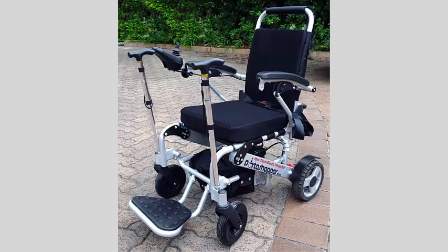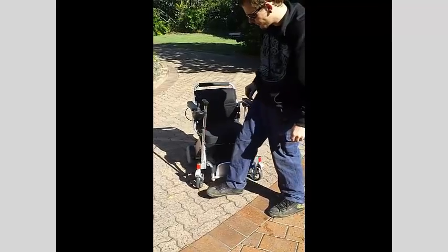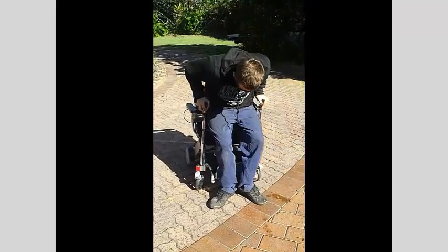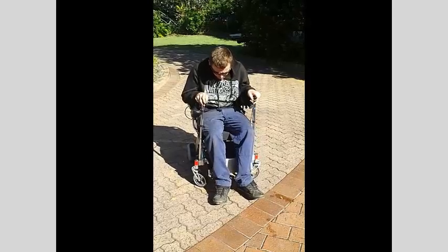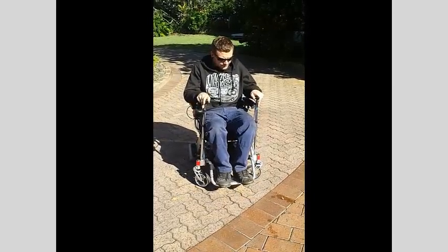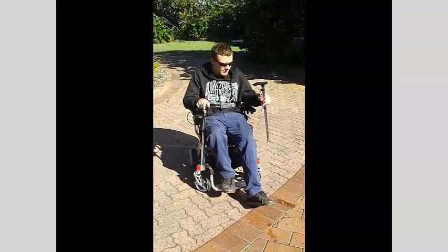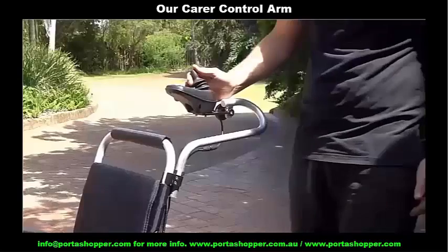Further to that, we also include a pair of stand sticks which offer forward support for those who lack the balance to get into and out of the wheelchair without assistance. These adjustable handles slot into the front caster brackets, but the Portashopper Grand and Super Grand Mk1 cannot accommodate them. Also, if you use the swing out footrest on the other models, the stand sticks won't fit either as the attachment brackets for the swing out footrests are in the way.